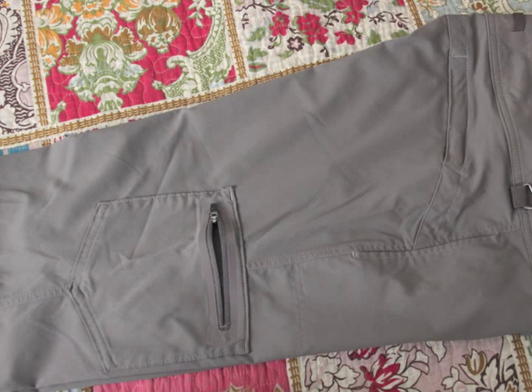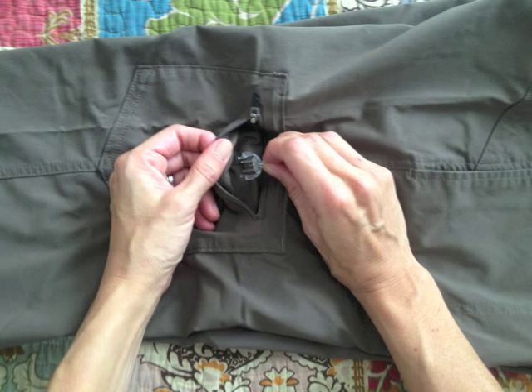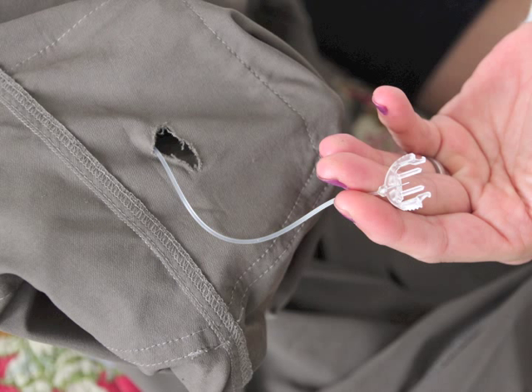Turn the pants inside out again. Grab the head of the catheter. Reach for the inside of the pocket. Pull the catheter out through the hole.